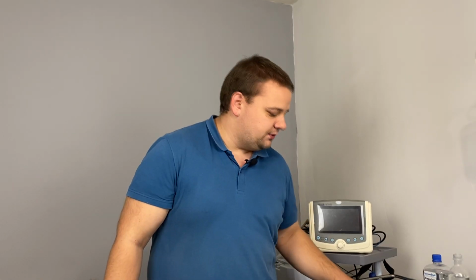Usually we use curved blades in adults and straight blades in children, but that generally depends on the experience and just the general habits of the doctor. So every blade is all right if you know how to use that. And this also applies to all airway management. Every airway management device is useful and okay if you do know how to use that.